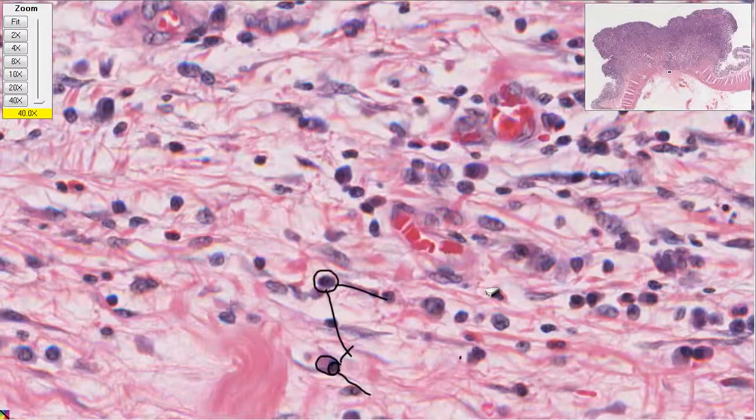Right, so that's a plasma cell, making antibodies probably against the tumor. And so that's the immune response in that spot. How do you know that? I mean, that looked very similar to the cancer cells. This one's a little hard to tell. If you had a real microscope, you'd turn up the light, and it would have a very specific look to the nucleus. And then these guys over here have little pink granules in them, which is a type of immune cell.